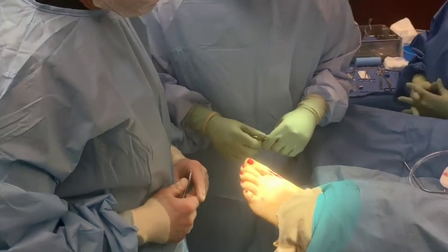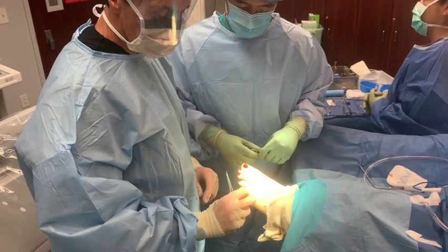And again, that'll absorb over time, but it will keep it straight long enough for it to scar perfectly in place.